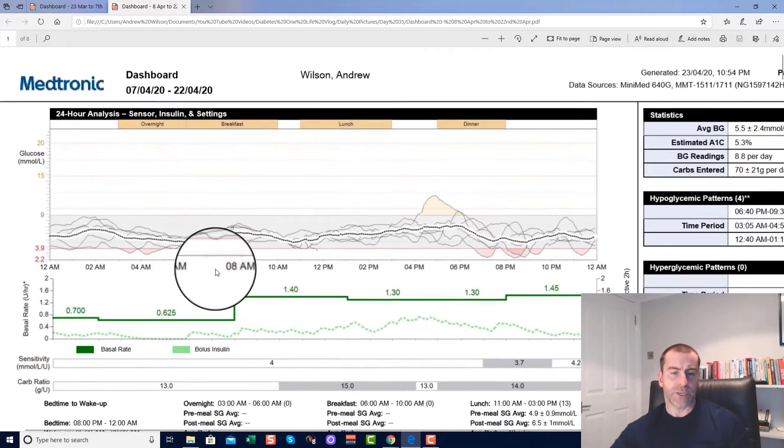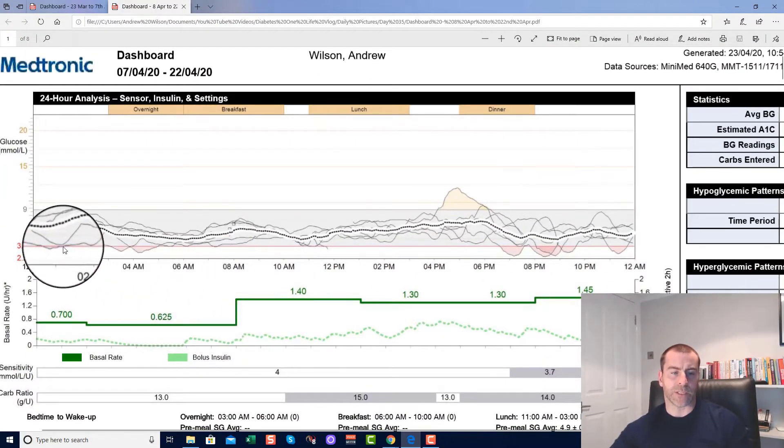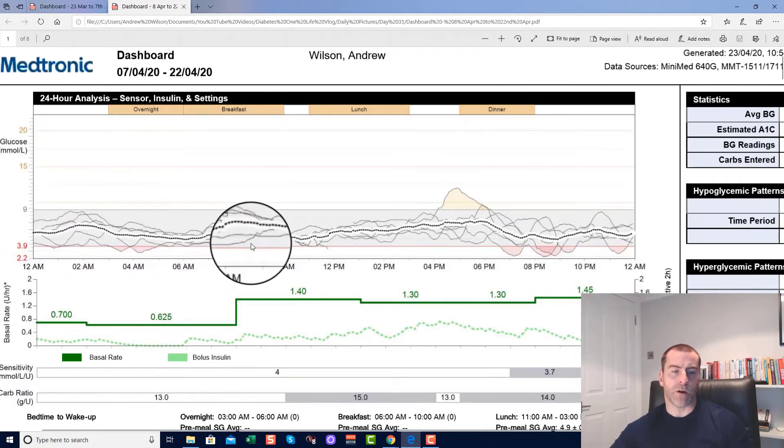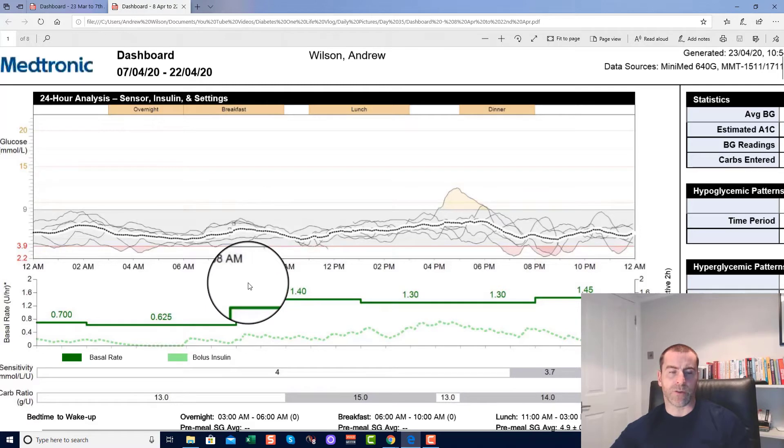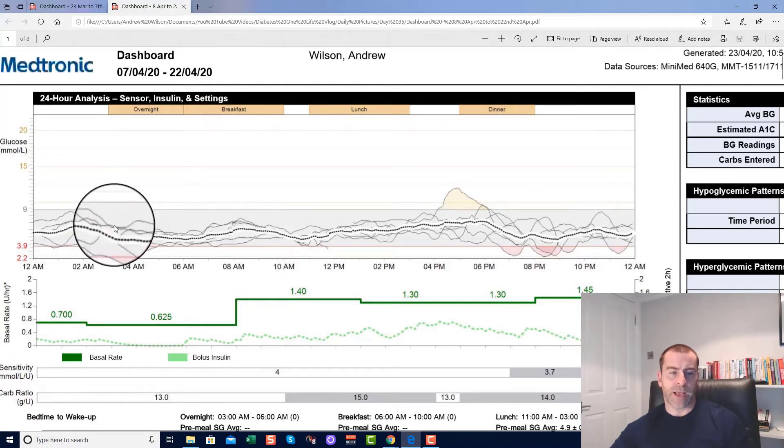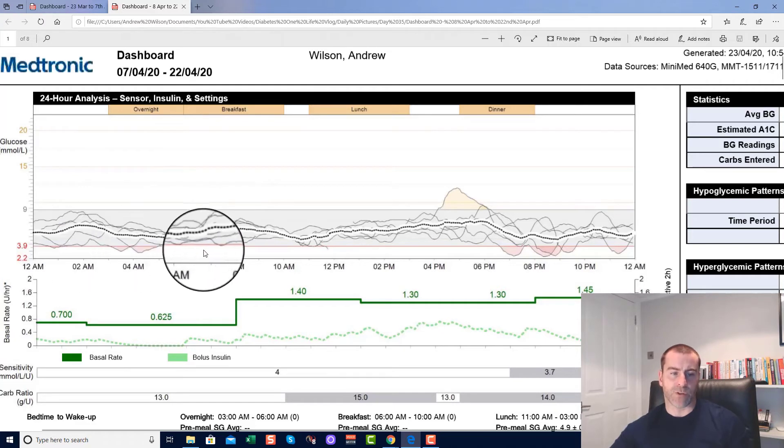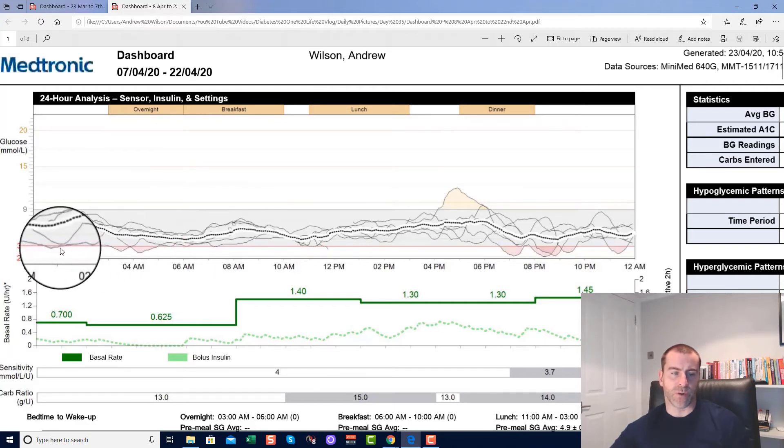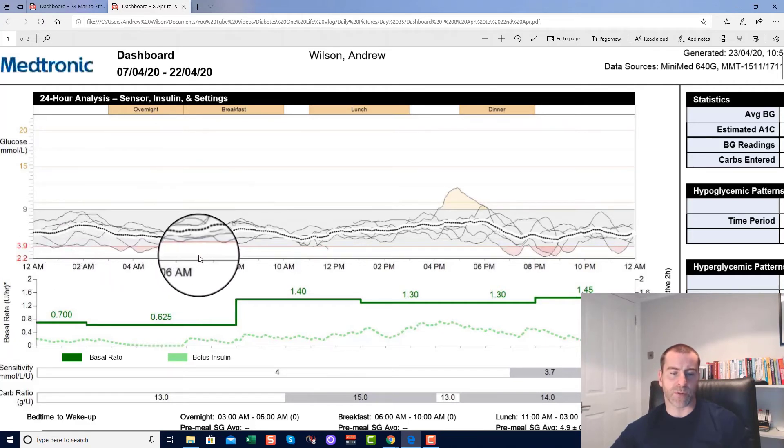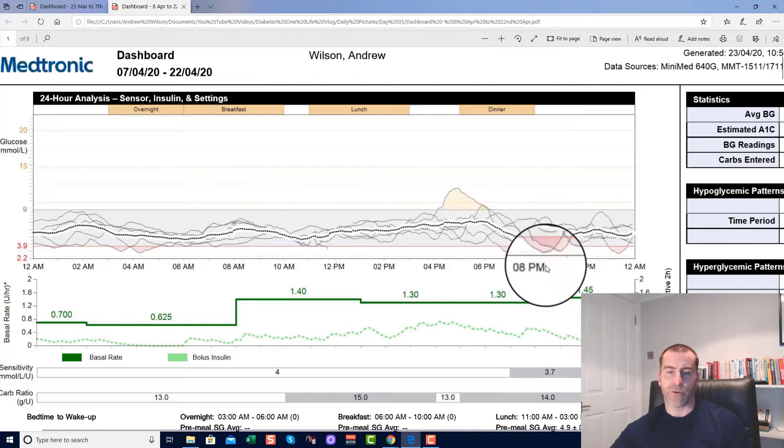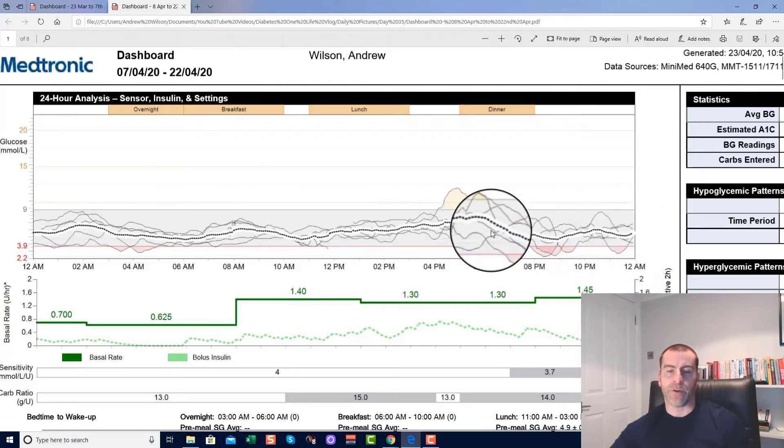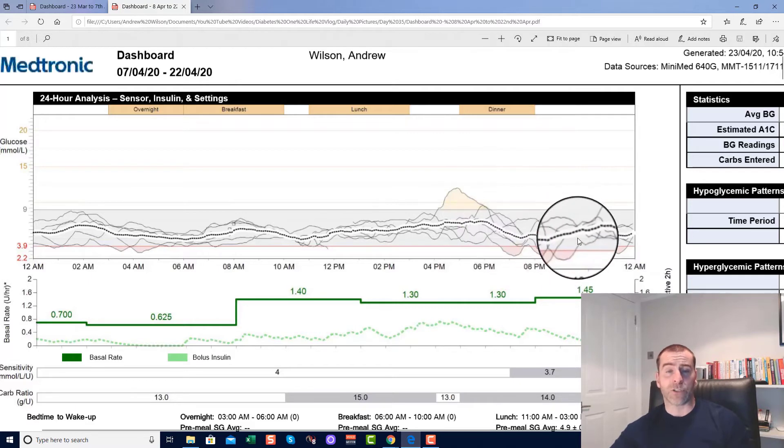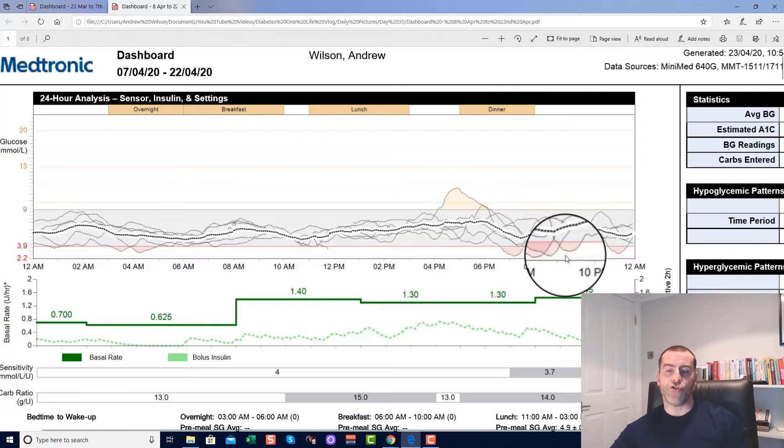You can see the first thing on this graph is less lows in the morning. We worked quite hard, numerous adjustments to those overnight basal rates. That is a stark difference. The fact is I haven't gone too high, I haven't gone too low too often—once, twice, three times. I'm not too unhappy with that. We're still getting periods whereby I'm too low of an evening though, and what I'm putting that down to is the training, the running really. There's no other explanation for that apart from that my basal rate isn't quite correct.